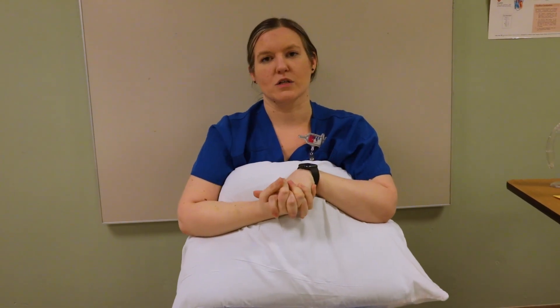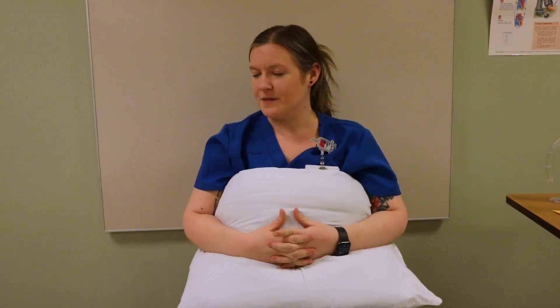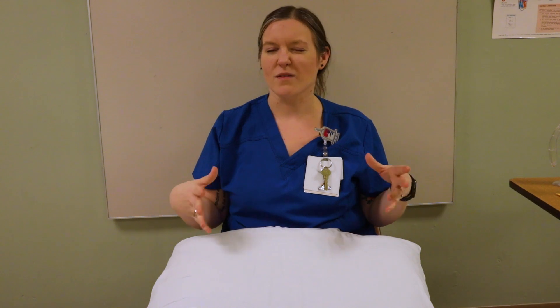Then you teach your patients to take a deep breath in and really cough. A lot of patients do a weak cough, and when they do that it doesn't work as well — it grinds those incision areas and hurts pretty bad, and that good cough isn't getting that junk out. Tell them to take a deep breath in and then cough. Manners don't count here, so they can do that big cough. We want them to do a couple of coughs an hour, usually about five to ten. Make sure you look at your facility policy.